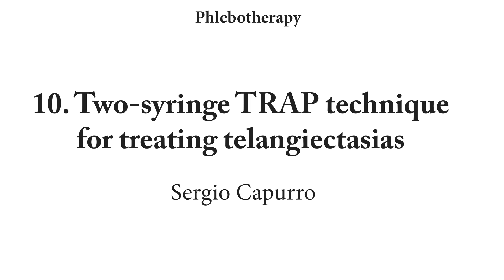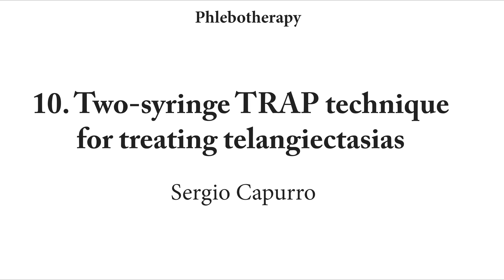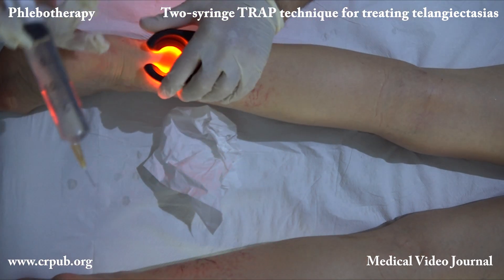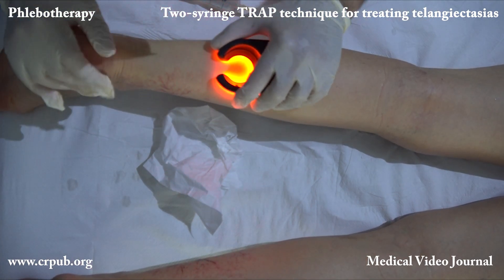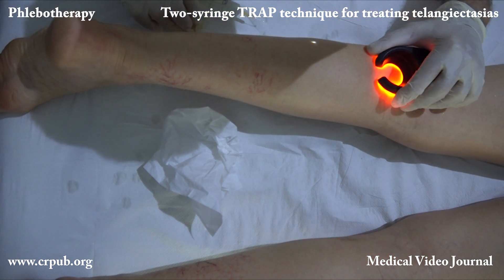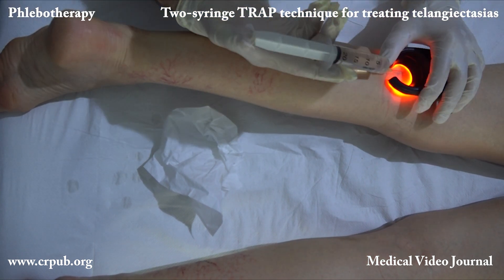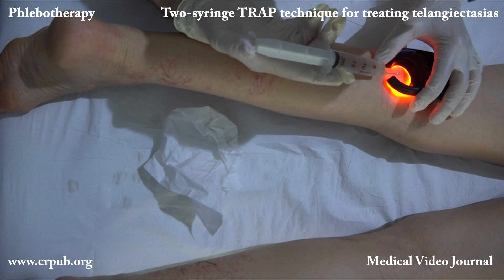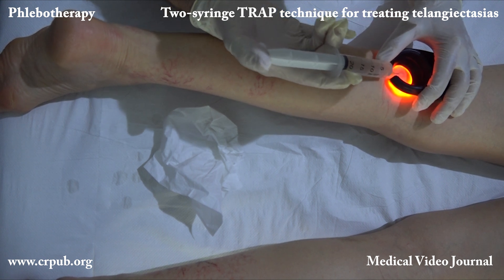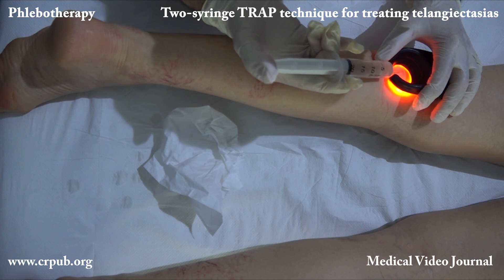The Two-Syringe TRAP Technique for treating telangiectasias. Three-dimensional Regenerative Ambulatory Phlebotherapy, TRAP, corrects hemodynamic hypertension of the venous circulation in the limbs, the anatomical cause of which is the valvular incontinence of the perforating veins.